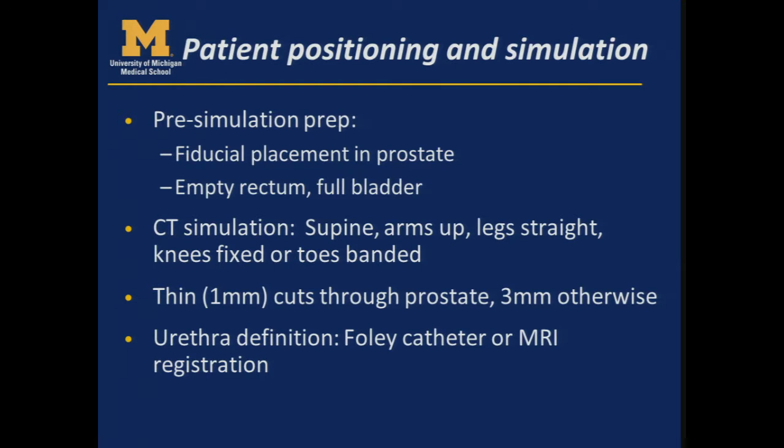That's not something you can see on a non-contrast CT scan typically, and that needs to be marked out either with placement of a Foley catheter, an injection of some radiopaque contrast, or a catheter that is visible on a CT scan, or using an MRI registration to fuse that to really see the urethra, because again, it's really invisible on a regular CT scan, and we don't want to put high dose in the urethra because it causes a lot of toxicity.